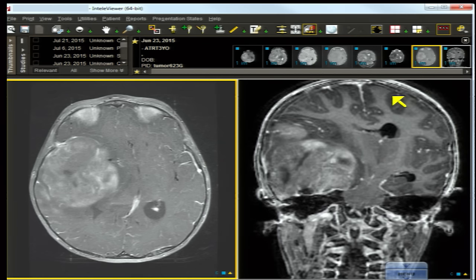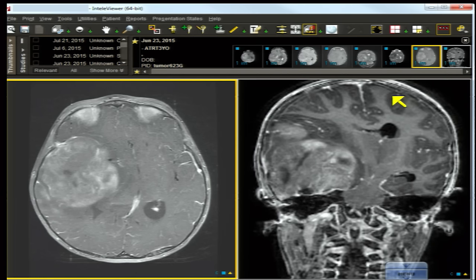Gliosarcoma lesions are exophytic from the brain stem and may arise from pontine gliomas, similar to GBM. Choroid plexus papilloma is intraventricular — our mass is not, so it's not a consideration. Choroid plexus papilloma enhancement is more intense and homogeneous, and the mass resembles a giant piece of cauliflower, whereas this mass is smoother, even though it infiltrates parenchyma.